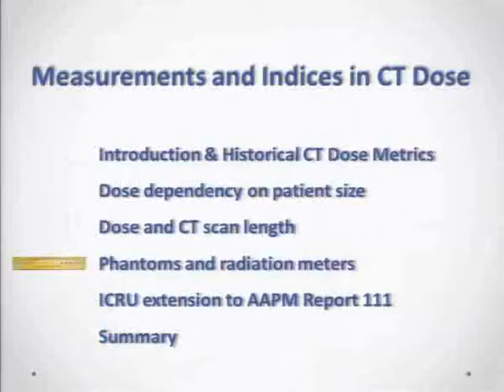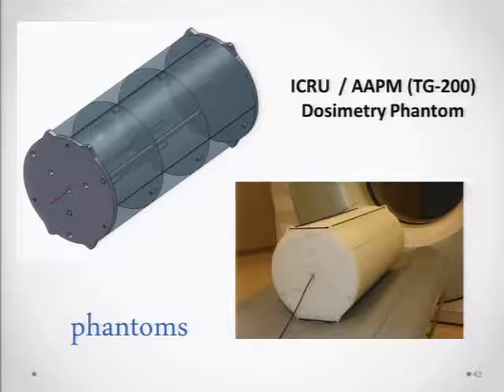Okay, so this gave rise to some discussions about phantoms and radiation meters. Let me just introduce those. And I'll call this the ICRU AAPM TG200. So TG200 was formed. The notion of a phantom became too controversial to ever get TG111 off the ground, and so we agreed to punt on that and defer that, and TG200 is where that was deferred to. And I worked closely as the ICRU representative, and Mike McNitt-Gray and Cynthia McCollough are also on the ICRU CT dose report team. And so this has come to be the ICRU AAPM TG200 phantom.